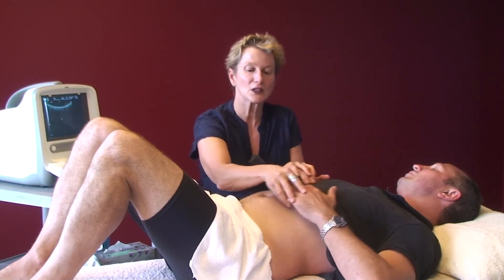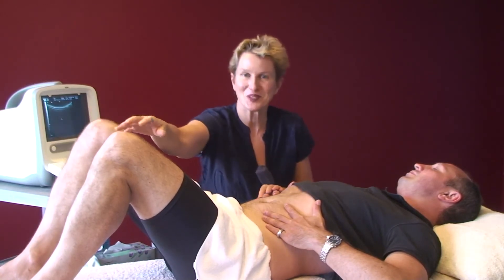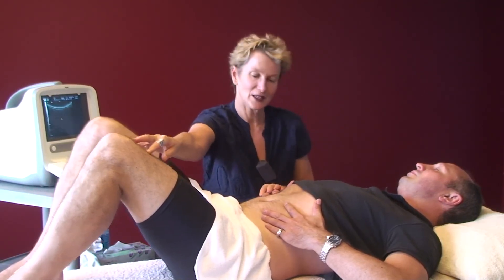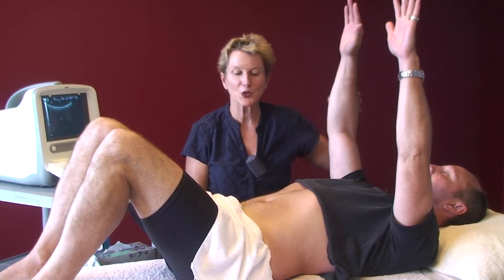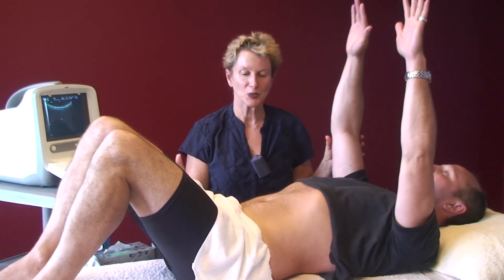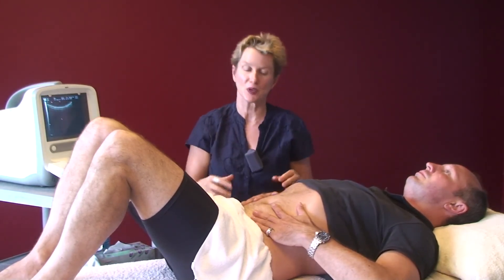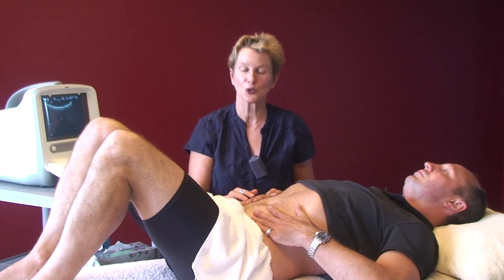Relaxing. Breathing in, breathing out — and drop one knee out, come back up again. Breathe in, breathe out — dropping the other knee out. Next: breathing in, breathing out — sliding the right leg out, come back up again. Then bring your arms in the air — I'm helping him turn this into a functional pattern. Breathe in, breathe out, engage — opposite arm and leg, come back up again. It's important that he practices this sitting, then progresses to standing. That completes our assessment of transverse abdominus. We're now going to look at assessment of pelvic floor.